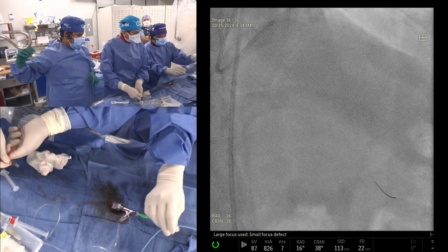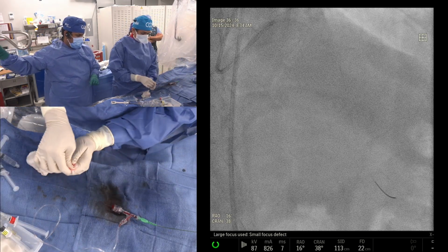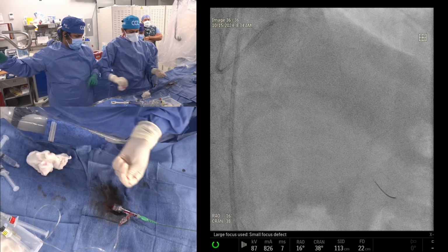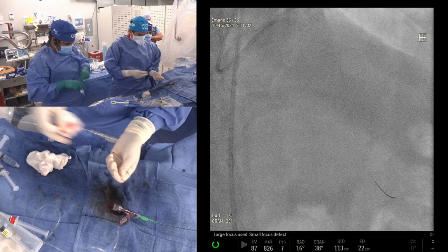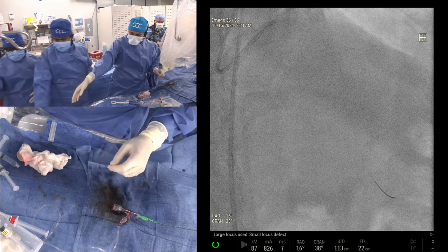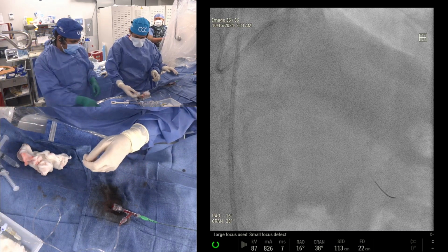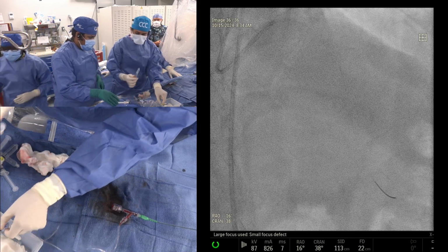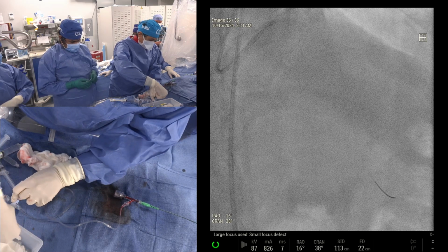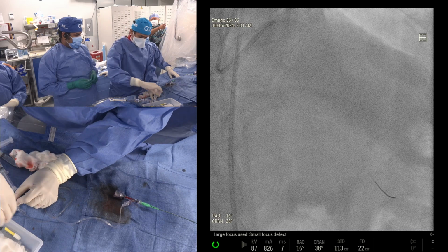Excellent crossing time. This is Dr. Mahmood El Rais, who joins us almost every time. He is always on the live case. Okay, let's give a little medicine and rehabilitate the vessel. No, let's IVUS now. No picture, but give some medicine. Let the vessel dilate a little bit and get the real vessel. The artery was sleeping until now, just woke up. Nitroglycerin, verapamil, all the good stuff. Epicardial vessels.